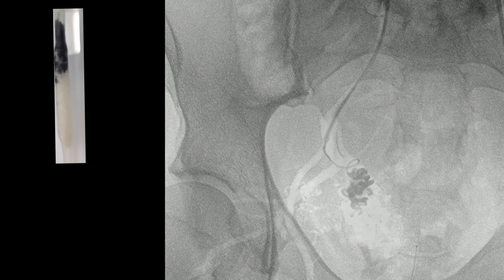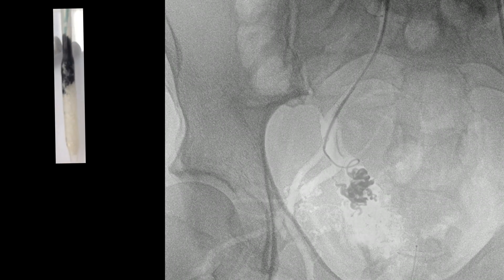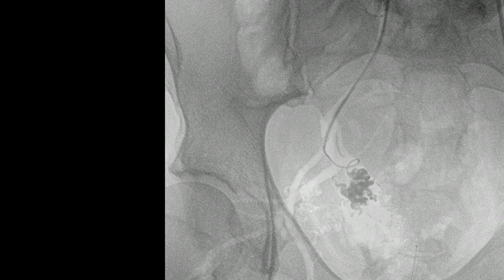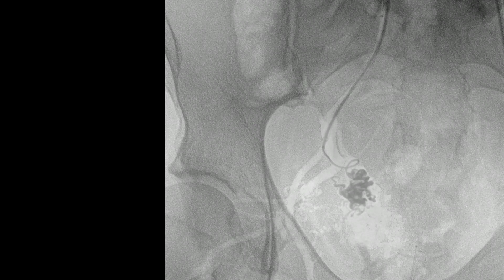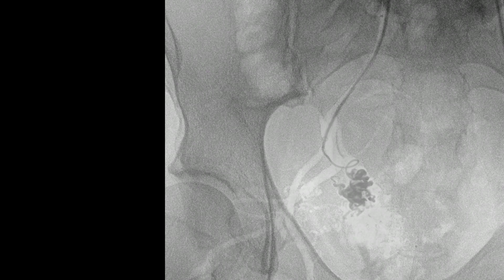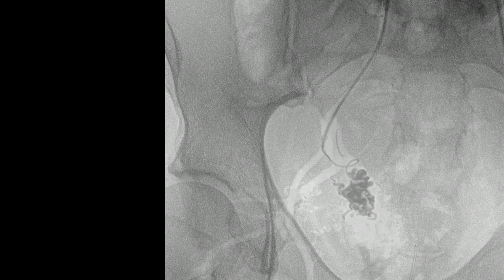The first thing you do is flush the microcatheter with DMSO. You need to know the volume for this catheter is 0.54 cc. This stops the onyx from polymerizing. You want a nice DMSO-onyx interface, and it takes a little bit of time because the onyx still has to fill up that dead space. Unlike coils, it beautifully goes down into all of these different branches, penetrating down into the arteriovenous malformation.